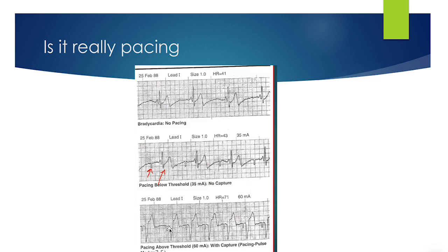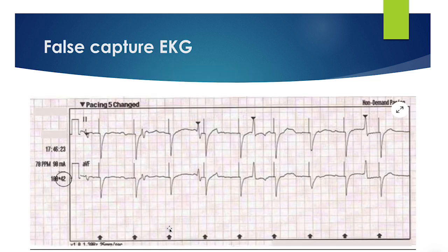Other surrogate markers that you're having good capturing and good pacing are that the patient's color will improve and your end tidal should improve as well, because now we have more perfusion, so you're going to have more gas exchange. And definitely be rechecking that blood pressure.